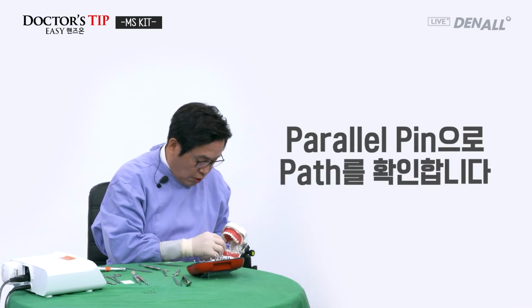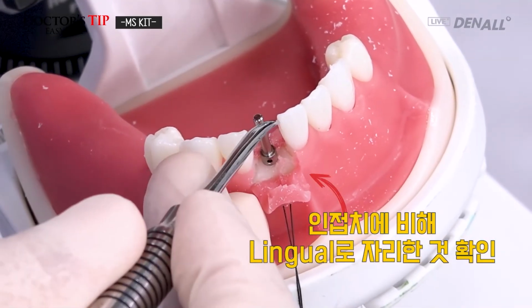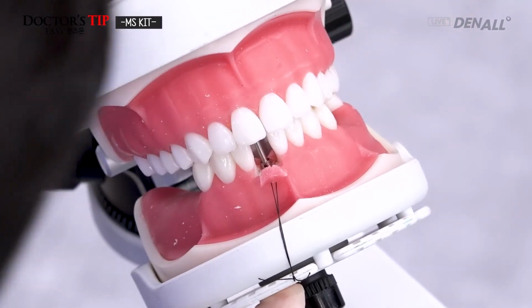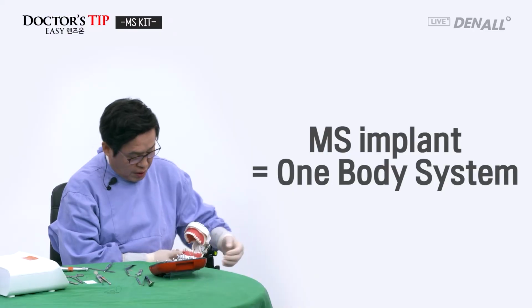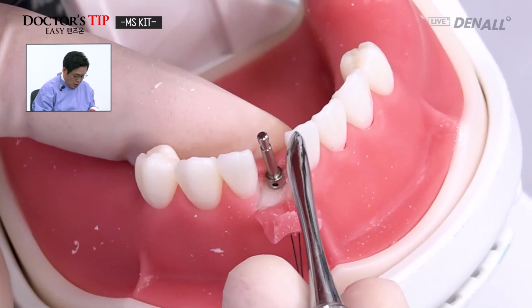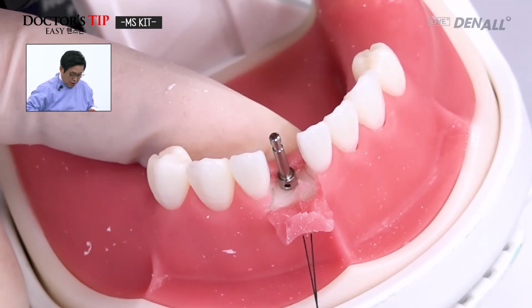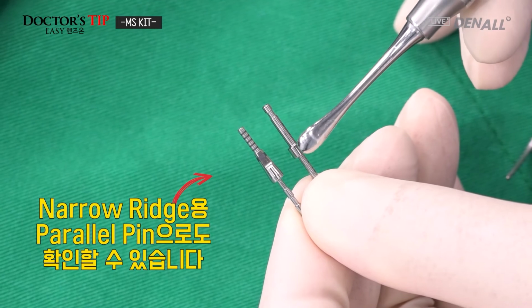I used a parallel pin to check the drilled position, and as you can see on the mandible anterior side, compared to adjacent teeth, it's tilted about 0.5 to 1 millimeter toward the inside. You check the positioning, and on the upper side, on the lingual side, it's the correct position. And again, this is a one body implant, so the path is important because you cannot change it with an abutment. In the adjacent teeth, you check against the incisal edge line. So it's tilted about 0.5 to 1 millimeter toward the lingual, and on the longitudinal axis, the path is like this, and this is the guide pin.